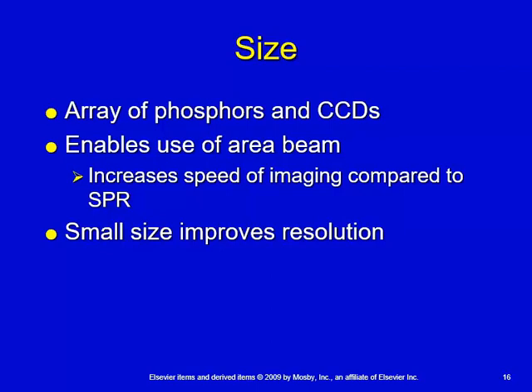It looks great on a small one, but if you use that same resolution matrix, same matrix size, then by the time you blew it up to an 80-inch TV, you'd have enormous pixels, and it'd be a TV that would be totally unwatchable.